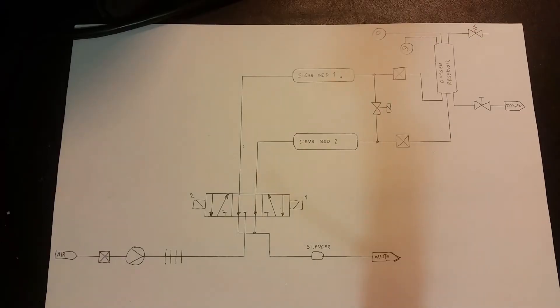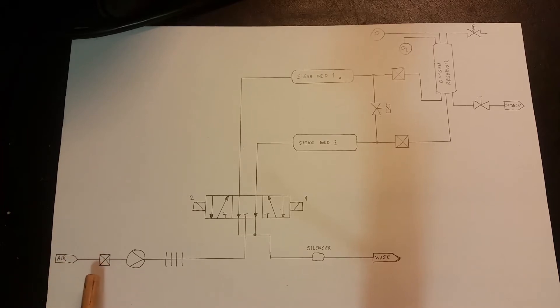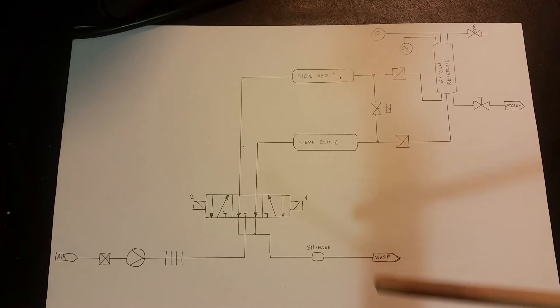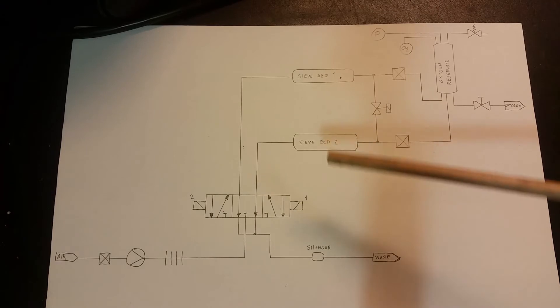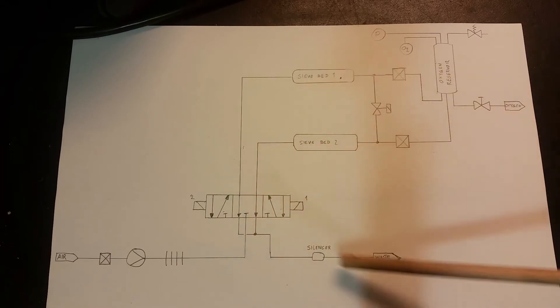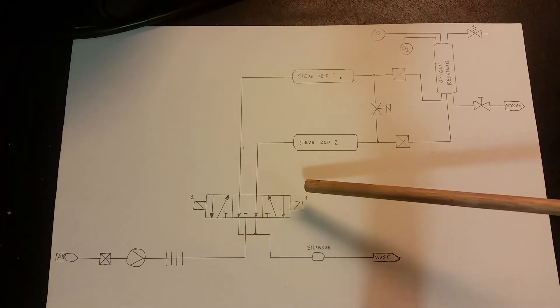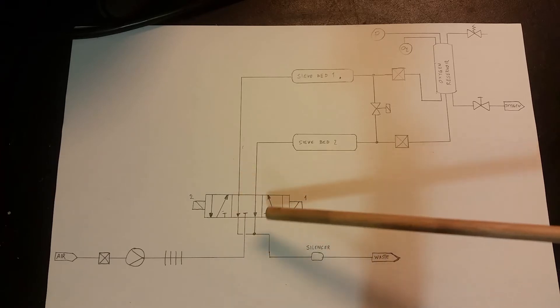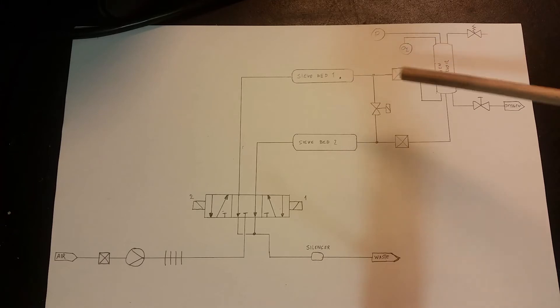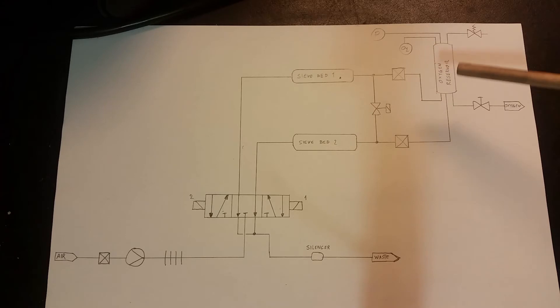Let's look at how an oxygen concentrator works. Here we have the pneumatic schematic: air first goes through a HEPA filter, then the compressor raises the pressure. We have some cooling fins — in this case just a looped discharge tube. It then goes to this valve pack with two solenoids. In the resting position, the two sieve beds are directly connected to the waste gas output. But if you energize solenoid one, pressure goes this way and charges one sieve bed, which begins to output pure oxygen.